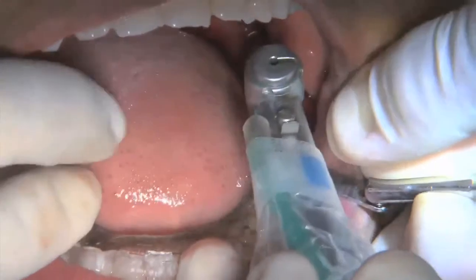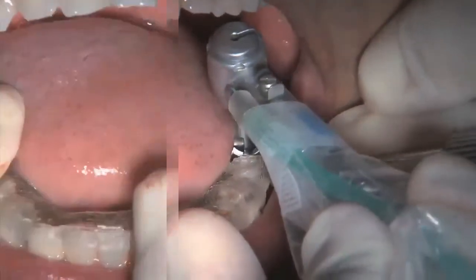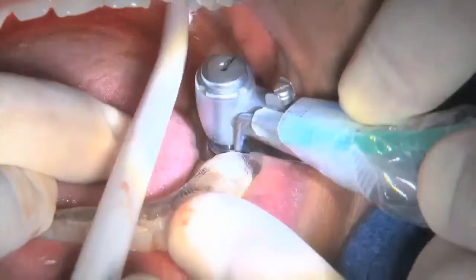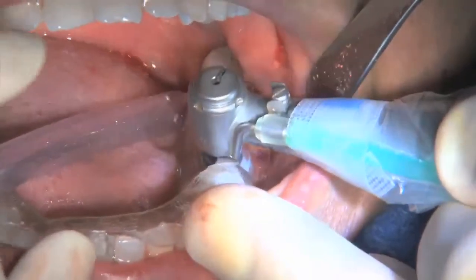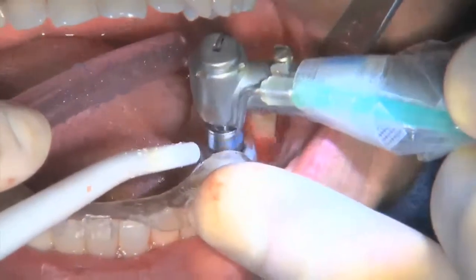The drilling sequence continues with the 3.5 by 8 millimeter drill, followed by the 3.5 by 10, followed by the 4.3 by 10, and finally the 5.0 by 10 millimeter drill with the corresponding drill guides. Each of these tapered drills has a built-in depth stop.